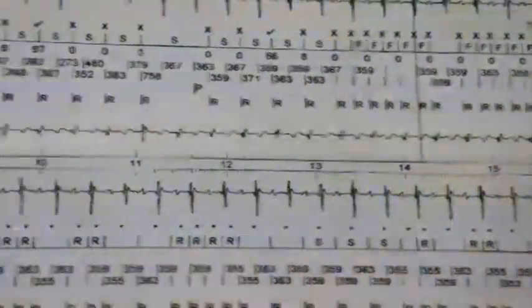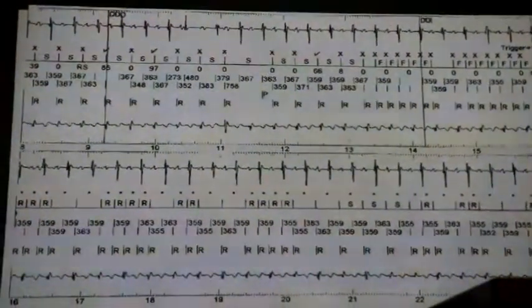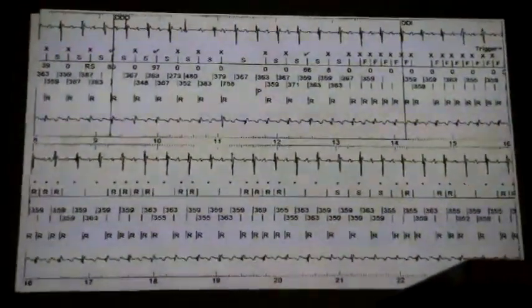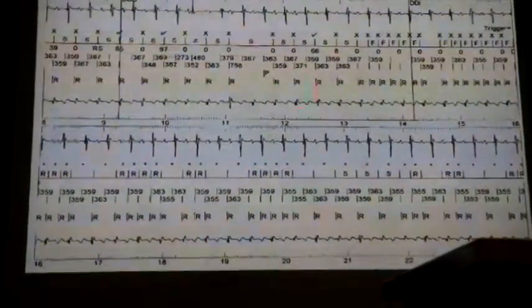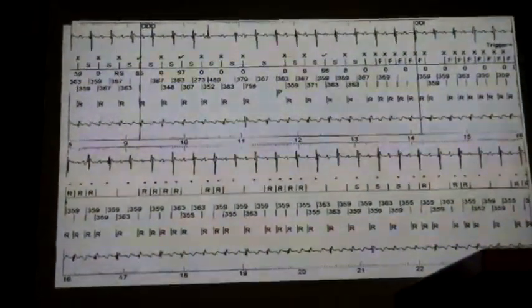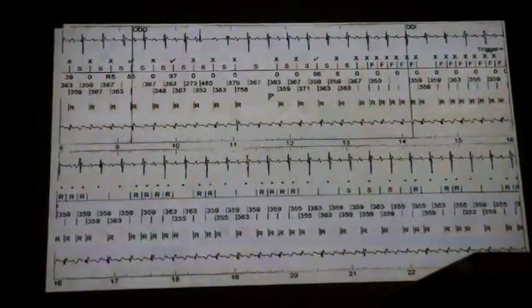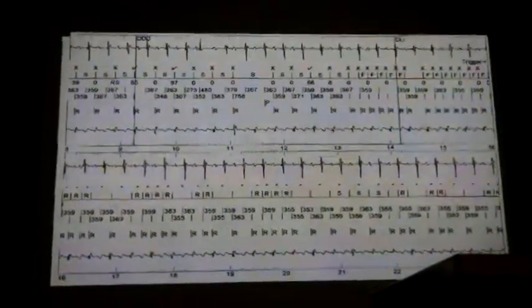Charging, charging, charging, charging. About a second later, it shocked him. Okay. So his R wave in this episode here was about 2. When I showed his R wave was 4. When he was doing this, it was 2. So we measured this signal here, and it was 2 millivolts.